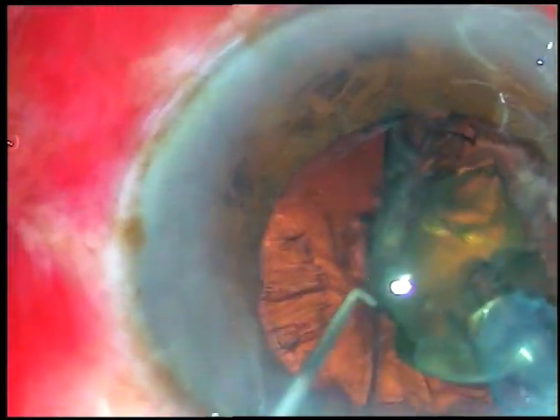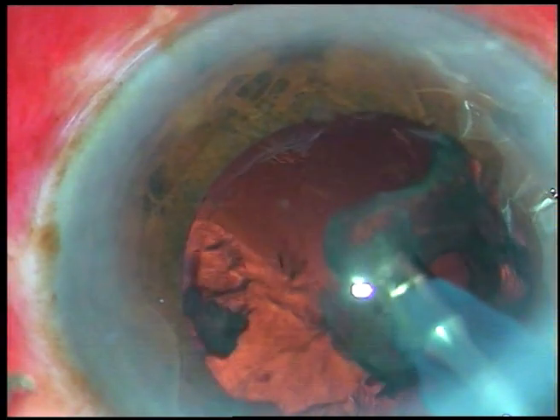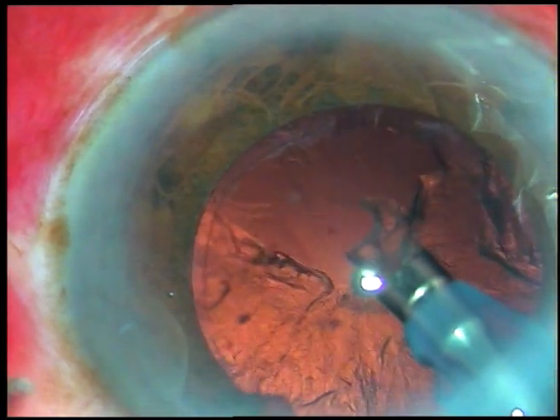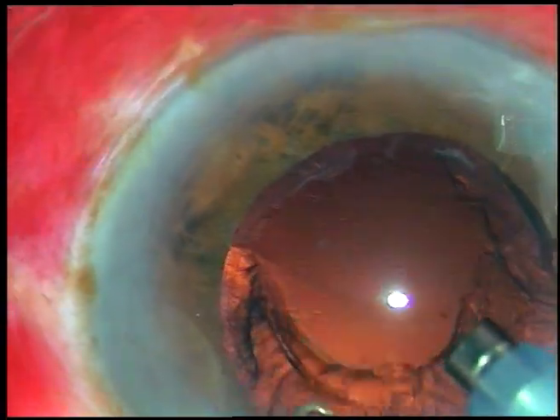This is called mechanical chop, and I learned this from Dr. Shri Ganesh, founder of Nethradhama Super Speciality Eye Hospital at Bangalore, India.